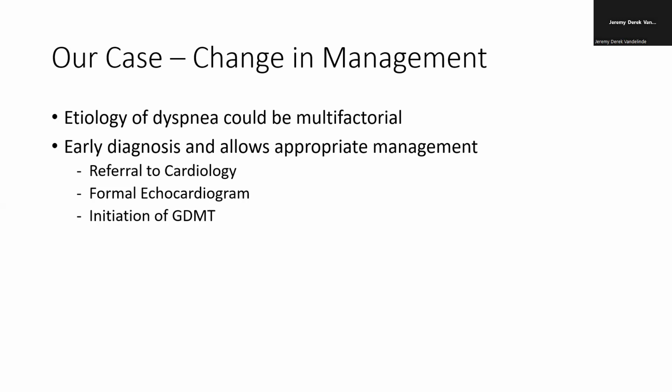So ultimately, LV systolic function is a very useful tool that can be done at bedside for these patients to both get an extra data point, as well as assess whether or not there's multifactorial etiologies to underlying presentations that these patients are having. So with that, I'll thank you guys for listening, and I'll toss it over to Qasim to chat a bit more about LV diastolic dysfunction.